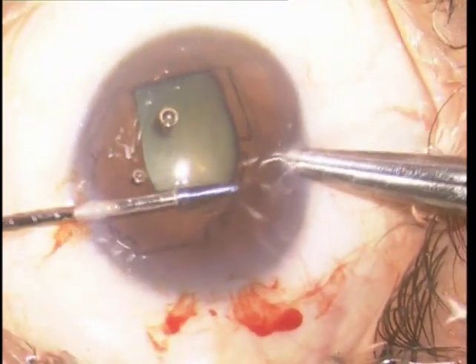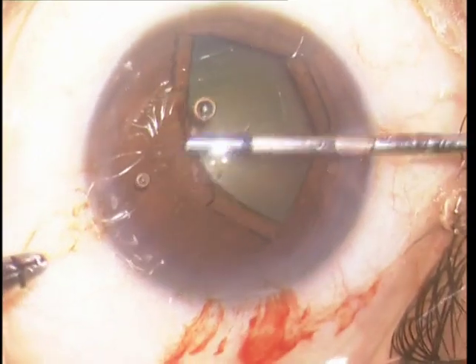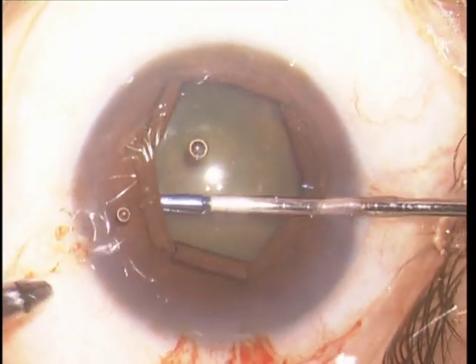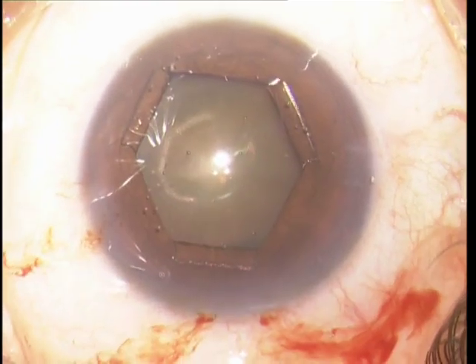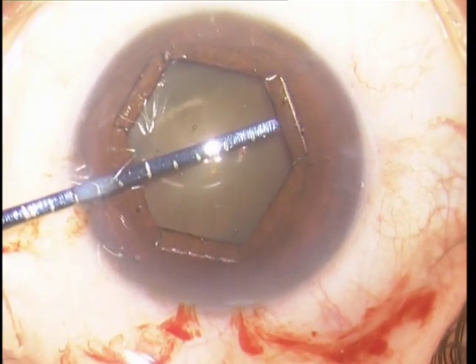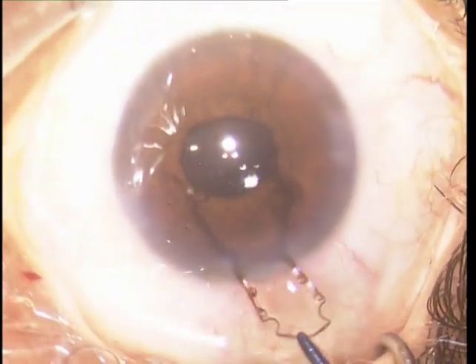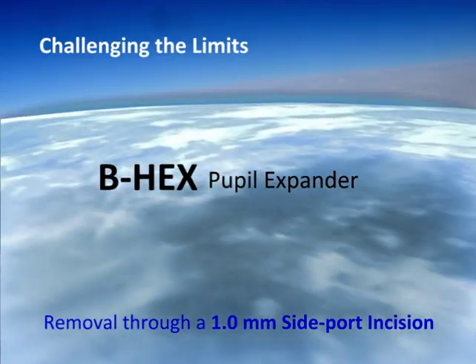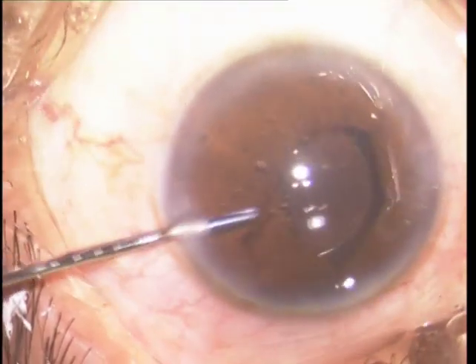As alternate flanges are tucked under the iris, the notches engage the pupil margin, resulting in an expanded pupil. Removal is so much easier than other devices that it can exit even through a one-millimeter side port incision.